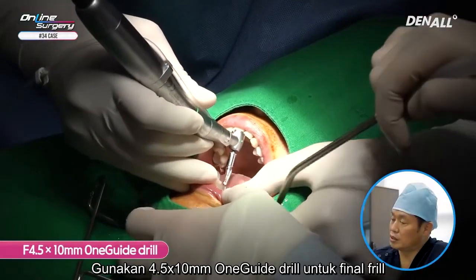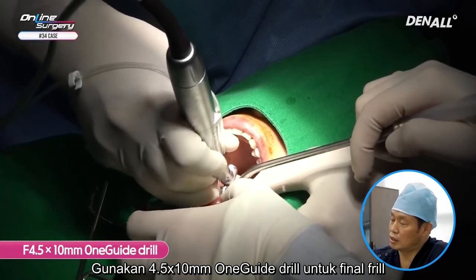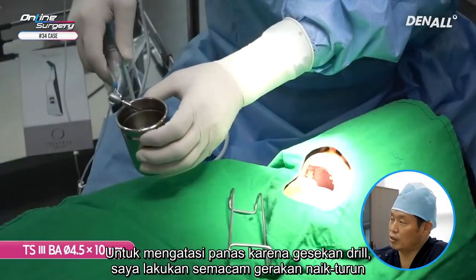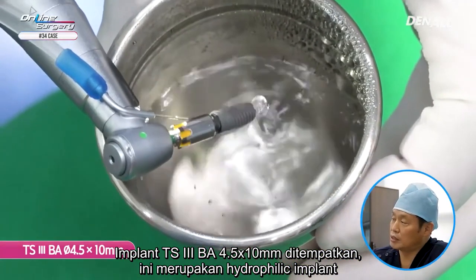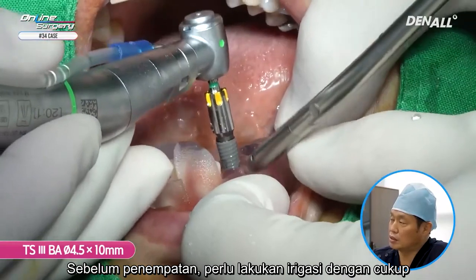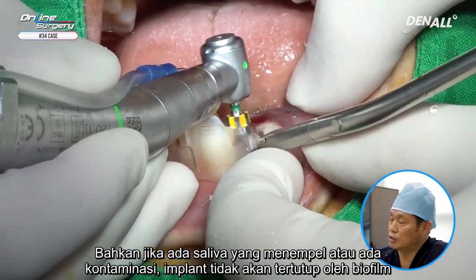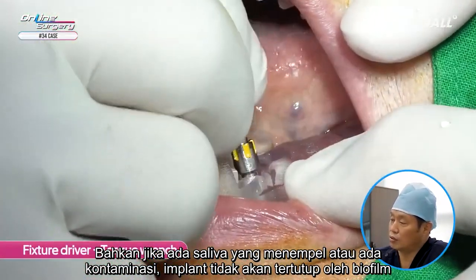For the final drill, a 4.5 by 10 mm one guide drill is going to be used. In order to reduce heat generation, I do a sort of pumping action. A TS3BA 4.5 by 10 mm implant is placed as mentioned. This is a hydrophilic implant. Before placement, you need to irrigate it sufficiently. Then, even if saliva gets on or if there's contamination, the implant will not be covered by biofilm.